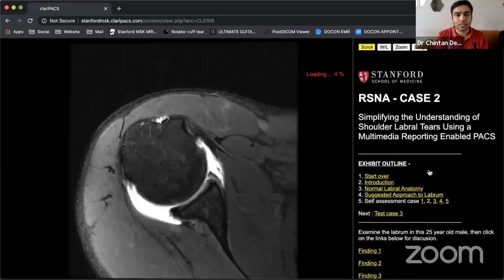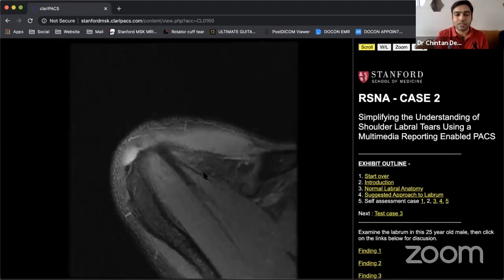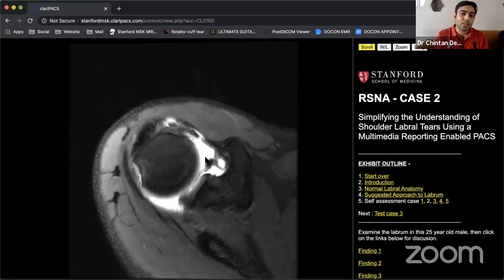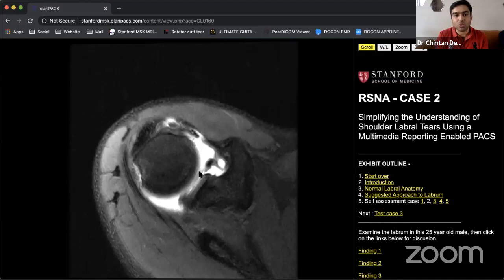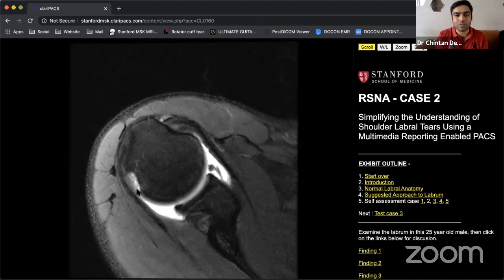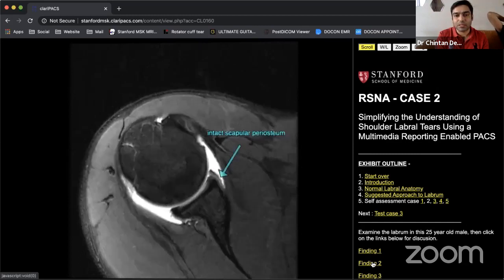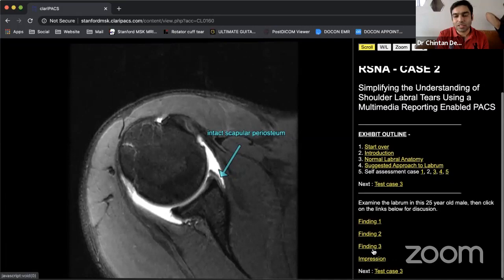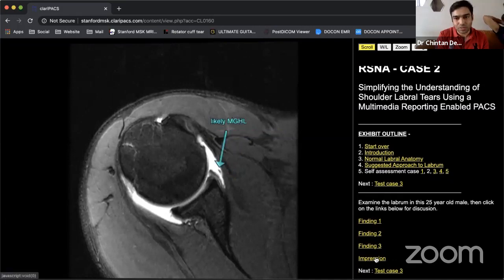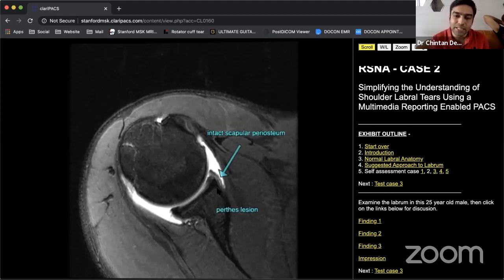In the next case, on the axial view, there is significant hemorrhage or bony edema — bright fluid in the joint — and the Hill-Sachs depth is more pronounced, a deeper Hill-Sachs lesion. There is fluid seepage but the periosteum looks intact, yet the labrum is torn. An intact periosteum with a torn labrum — any guesses? That is a Perthes lesion.